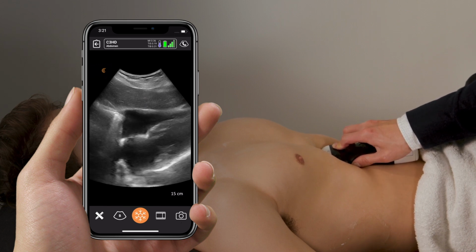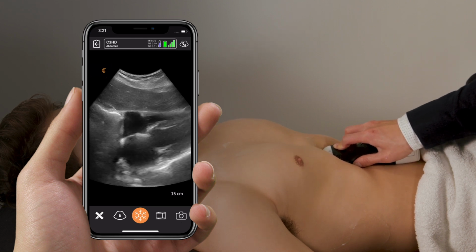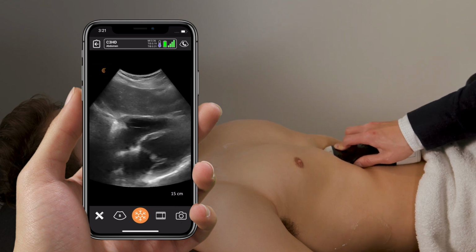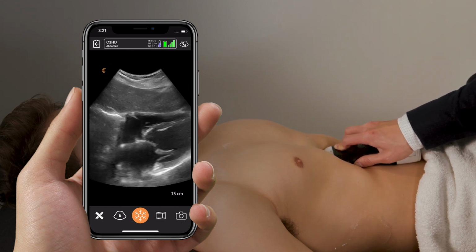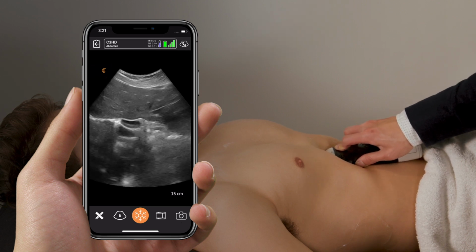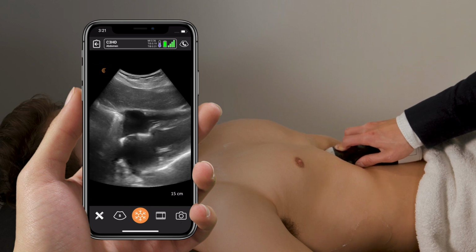Effectively, you want to visualize the right heart border all the way up to the septum in an appearance that looks like a 7, and then you know you have adequate visualization of the heart. And the idea here is that you want to sweep through, and we're looking for fluid along the right heart border that would be suggestive of a pericardial effusion.